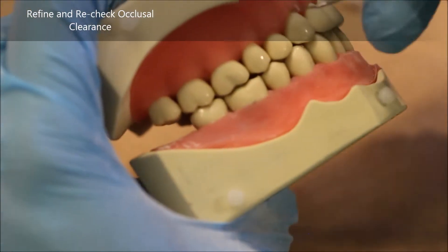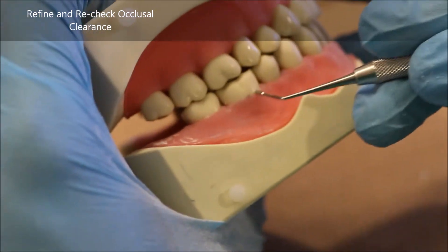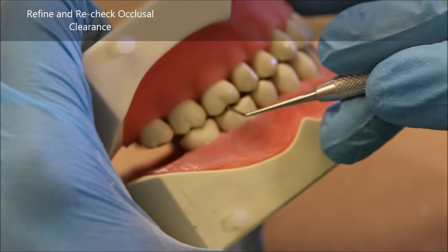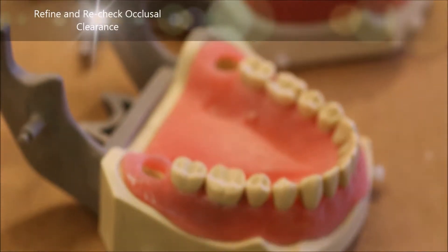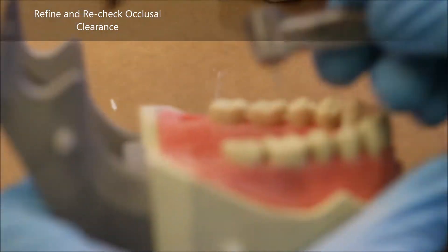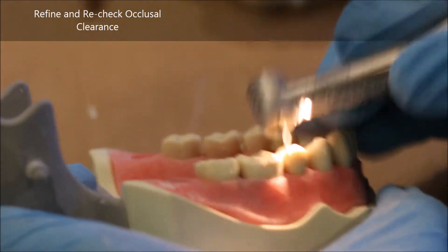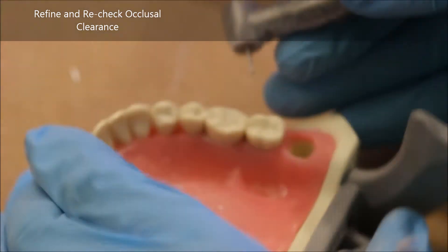Remember to periodically blow on your prep and keep the surfaces as smooth as possible. Let's check again — we can see a pretty clear gap. I take my RGS3 and try to slide it through. As I slide through the mesial buccal cusp of the maxillary, I notice it catches, so I know I have to go back and do a little more occlusal reduction in the mesial buccal and distal buccal areas of the mandibular tooth.